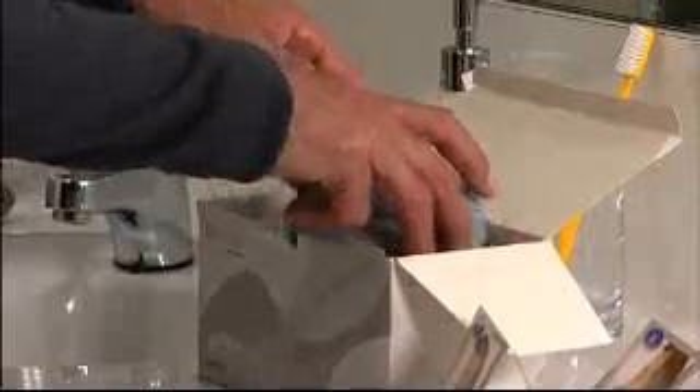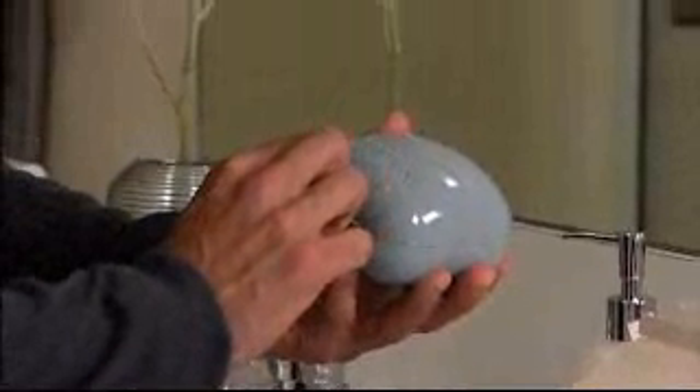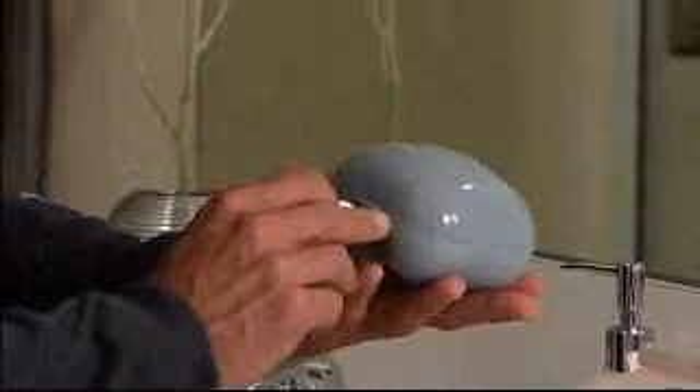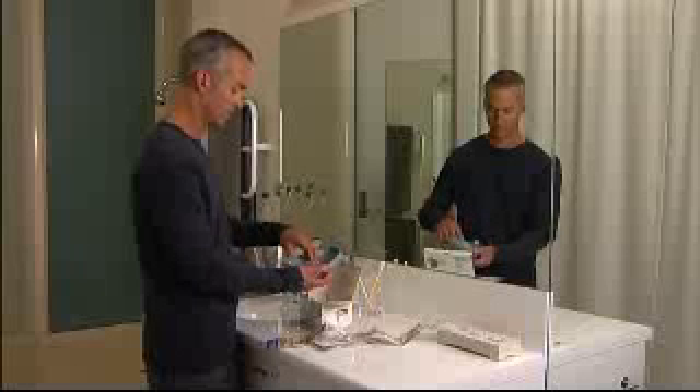Remove the grey container. To open, remove the tamper-proof seal. Squeeze both sides of the bottom half of the box and the lid will click open. Take the oracle from the box.